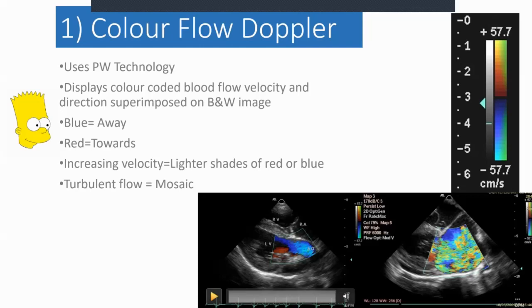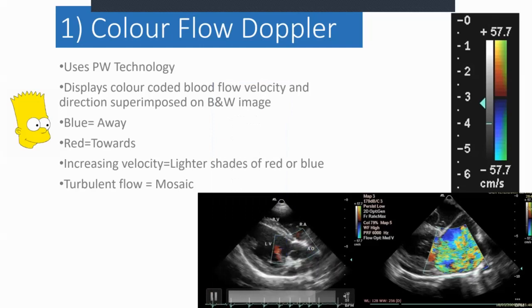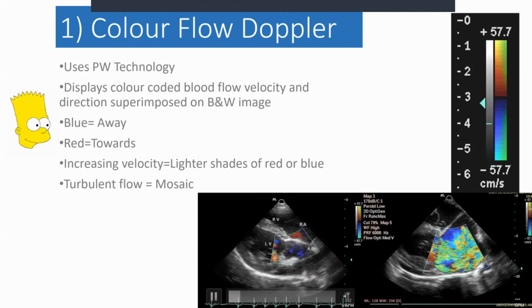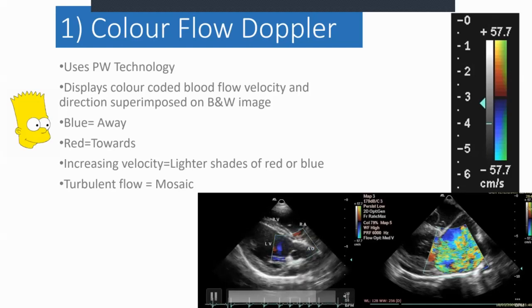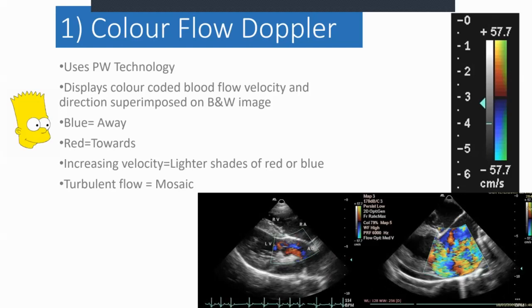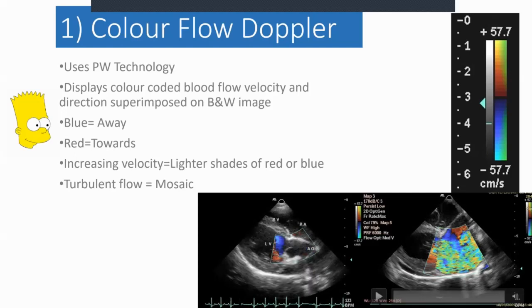Here's an example — this is aortic outflow. You can see a blue signal going through the aortic valve, pretty much all blue, signifying blood moving in a general direction away from the probe. That's laminar flow. Whereas on the right-hand side at the bottom is turbulent flow — this is a dog with severe mitral regurgitation, and you've got this mosaic effect created by the turbulence.